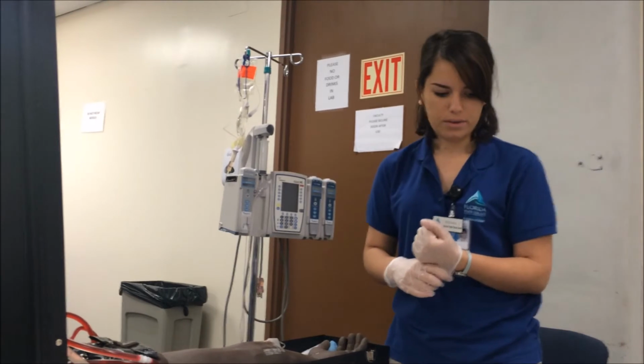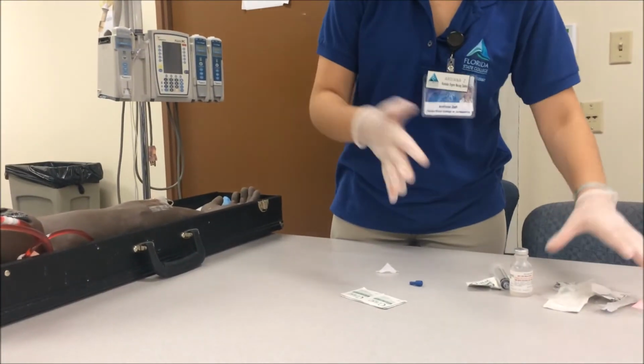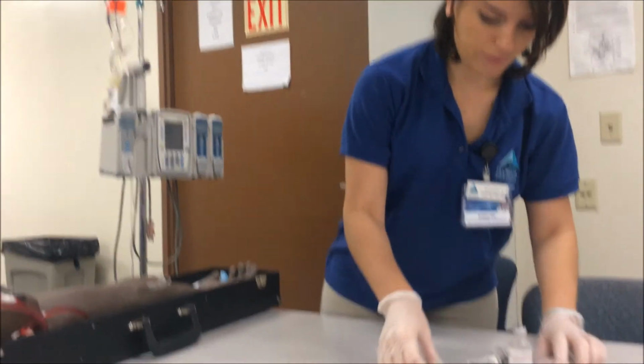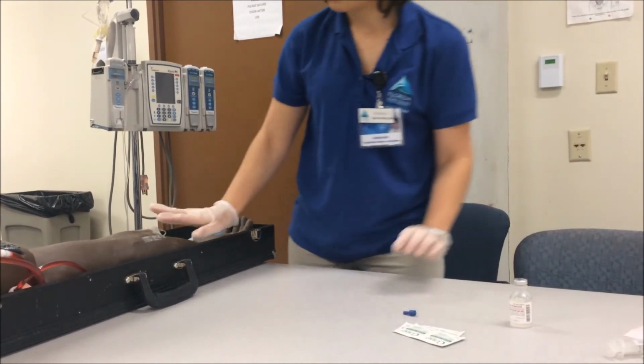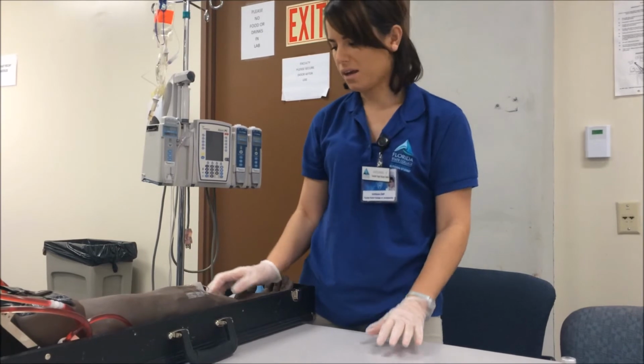And I will make sure to clean everything that I have used, and put my sharps in the sharps container and move everything else to the trash. And I'll make sure to keep an eye on my IV insertion for any tenderness or pain.